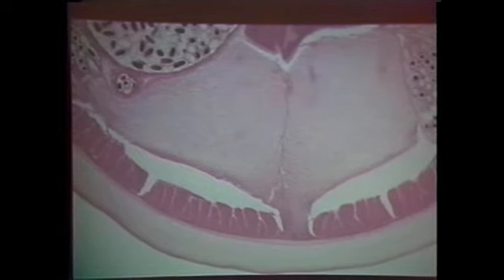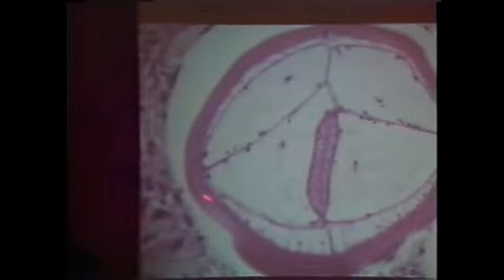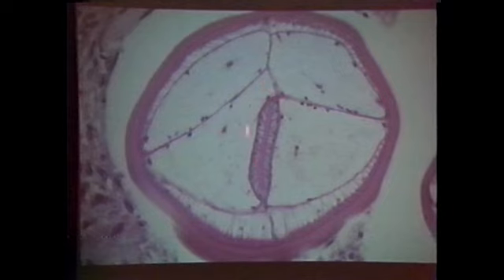Now I'm going to show you all different types of lateral cords. Look at this one. Do you see how this is like the same height, if you will, as the muscle? So this is a low lateral cord. Look at this nice little larva. Here's our muscle. There's muscle there. And look at the pseudocoelom taken up by lateral cords. That's the intestine. Huge lateral cords.